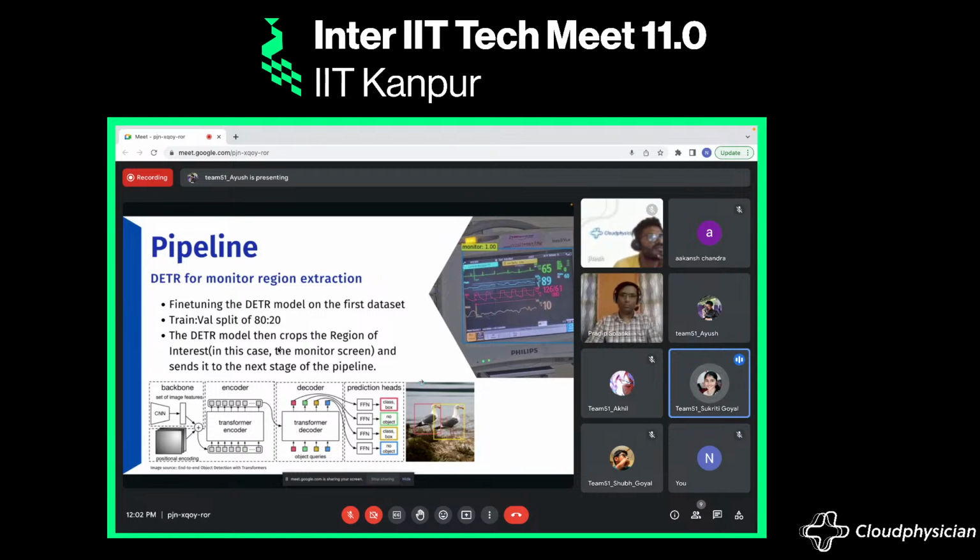After detection of the vitals, we cropped out the vitals from the monitor. In stage three, we used Parseq for text detection from the cropped vitals to get the values of the vitals. And now Ayush will go into a bit more detail.